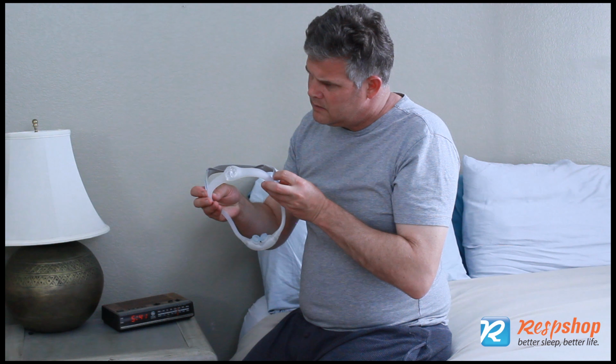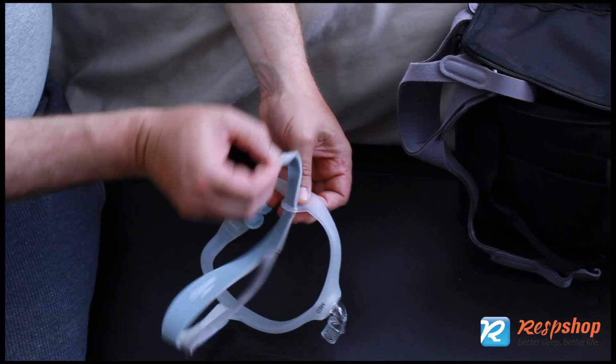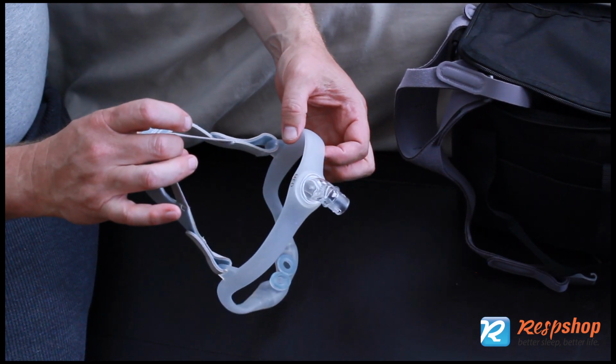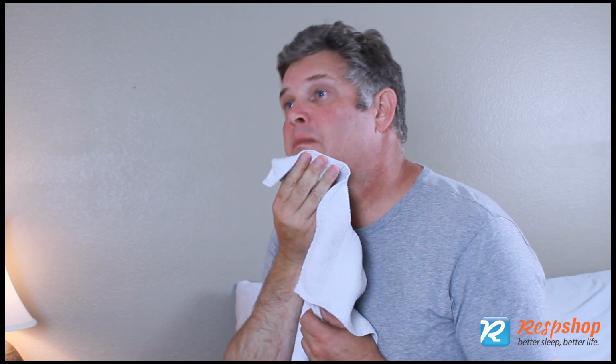For a mask that has been fitting just fine but now is not, be sure you are replacing the headgear and cushion on a regular basis. Headgear stretches out and the cushions break down. Also, clean your mask daily and wash your face before use. Dirt, oil, and makeup get in the way of a good seal.